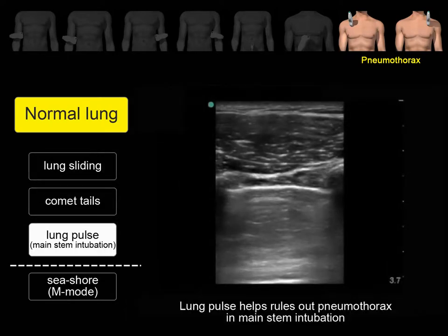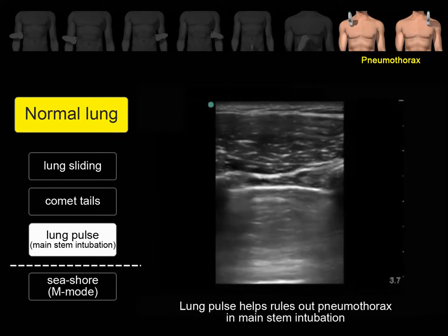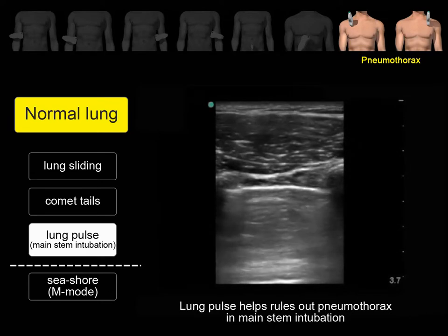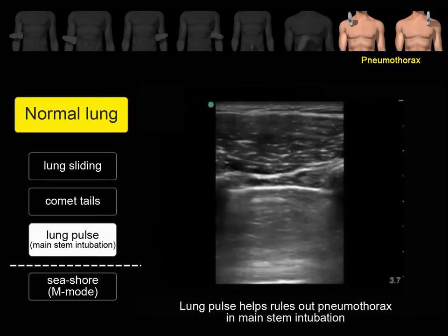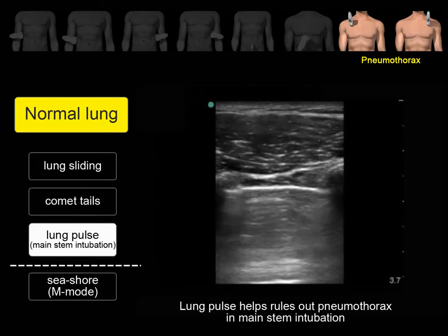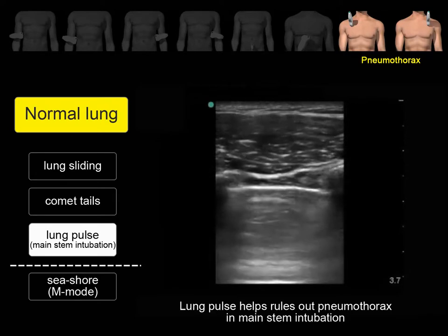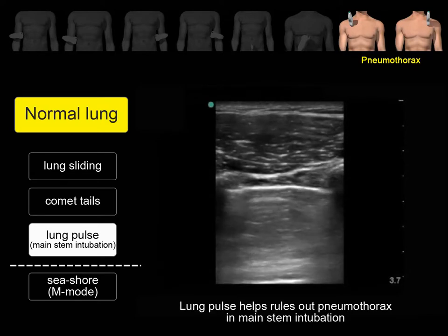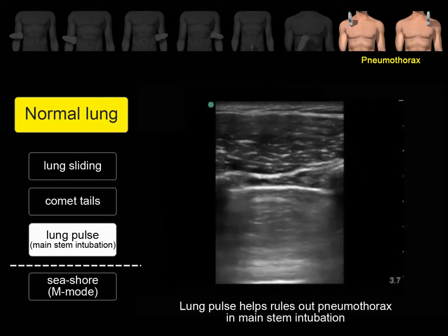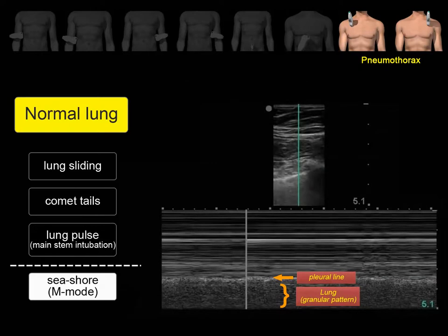During main stem intubation, lung sliding is decreased in the contralateral lung. In these situations, identification of the lung pulse rules out pneumothorax. Lung pulse is a pulsation movement in the pleural line representing cardiac activity transmitted to the lungs. In M-mode, a granular pattern will appear below the pleural line, representing normal lung sliding and ruling out pneumothorax. In most cases, as long as you see clear pleural line sliding, you don't need to run M-mode.